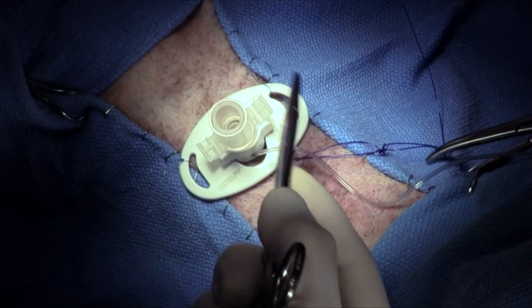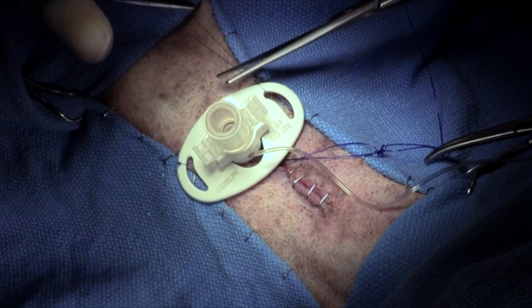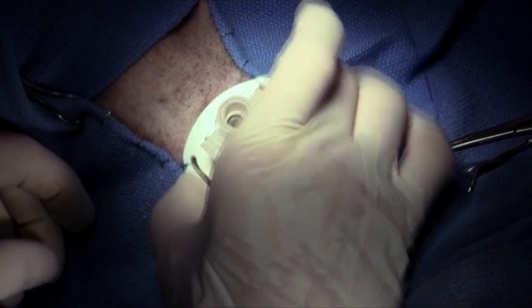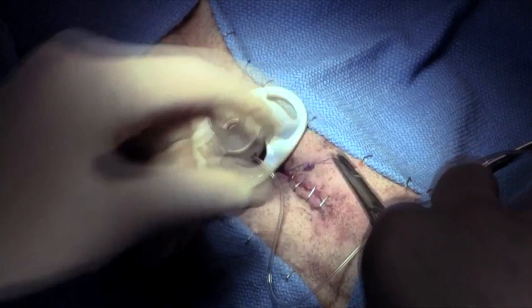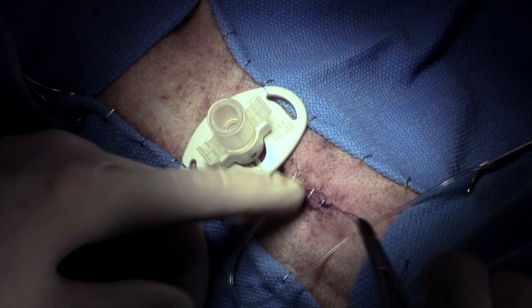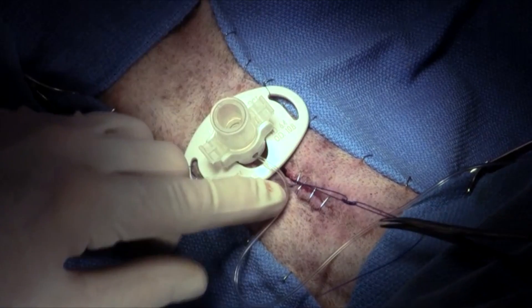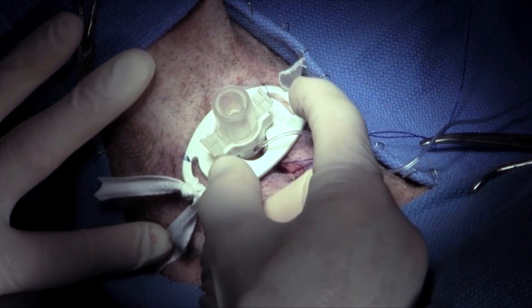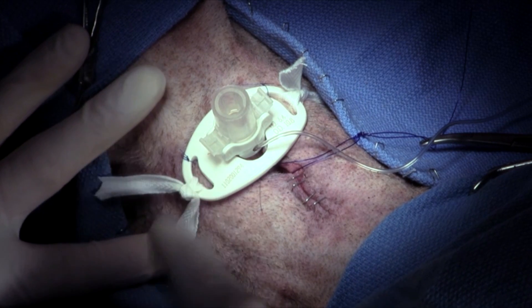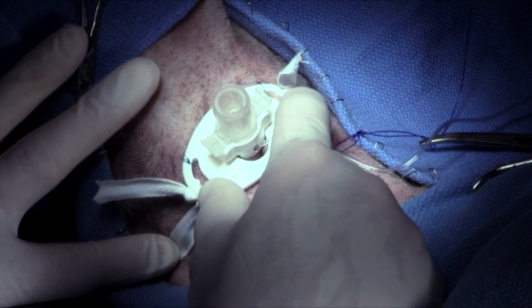Several sutures can be used on each side as the surgeon prefers to further secure the tube. Notice the safety suture protruding from the incision — this suture permits quick access to the trachea by pulling up on the trachea and exposing the tracheotomy incision should the tracheostomy tube become displaced. Umbilical tape has been carried around the dorsum of the dog's neck and tied in place, helping to secure the tracheostomy tube.